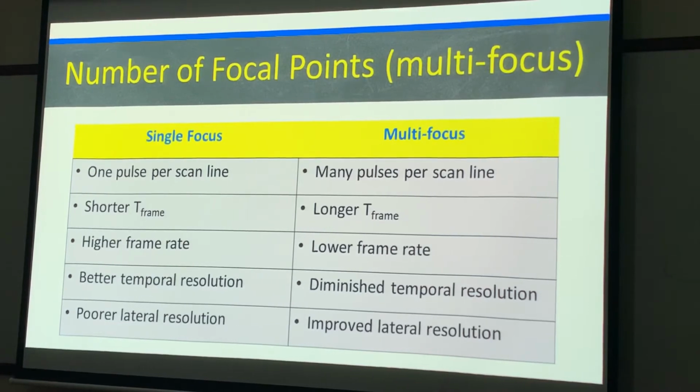But we're going to have poor lateral resolution when comparing it to multifocus, because that's the whole purpose of multifocus, right? It's to increase lateral resolution, to have our beam narrower over a longer distance. That's the whole point of multifocus: lateral resolution.